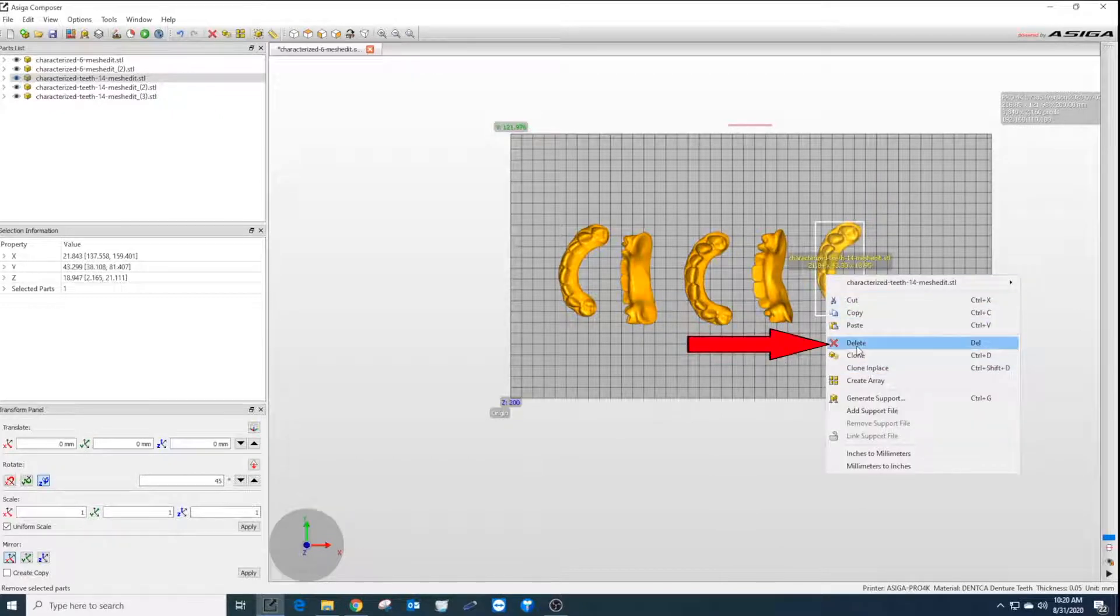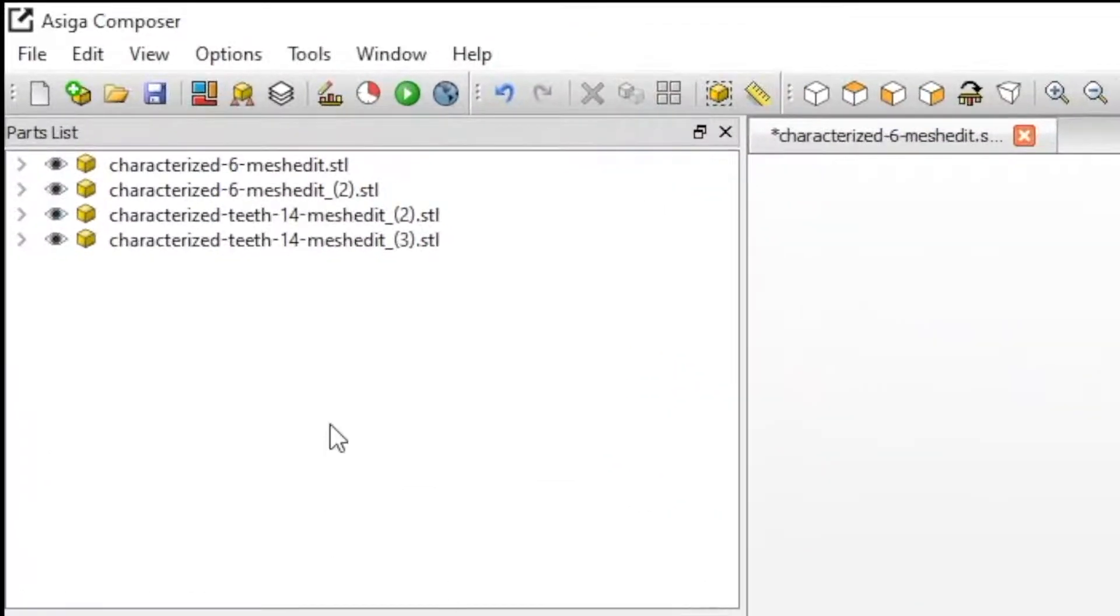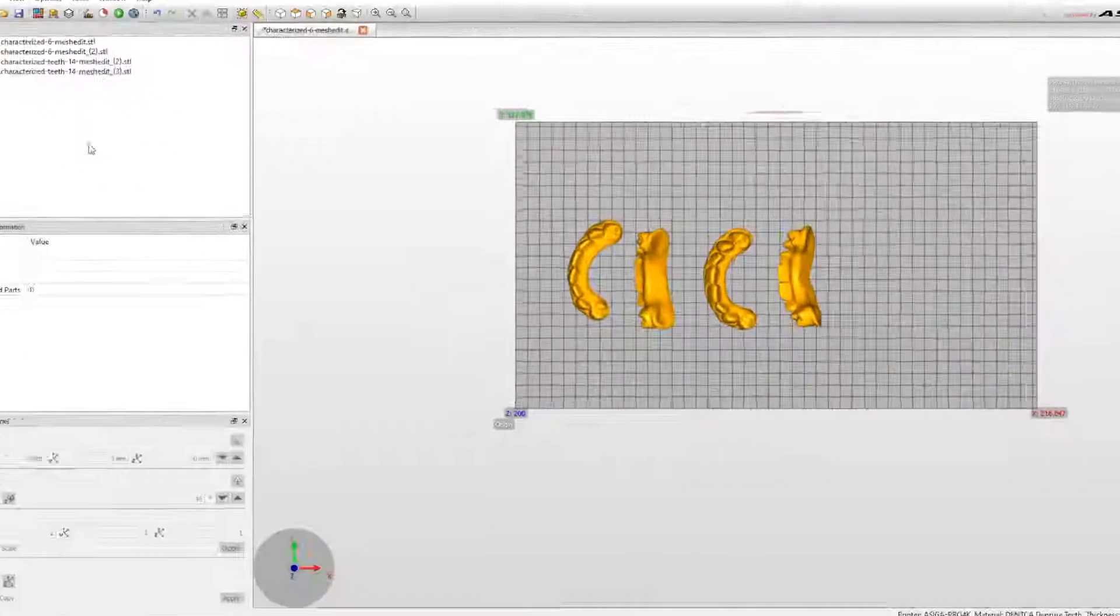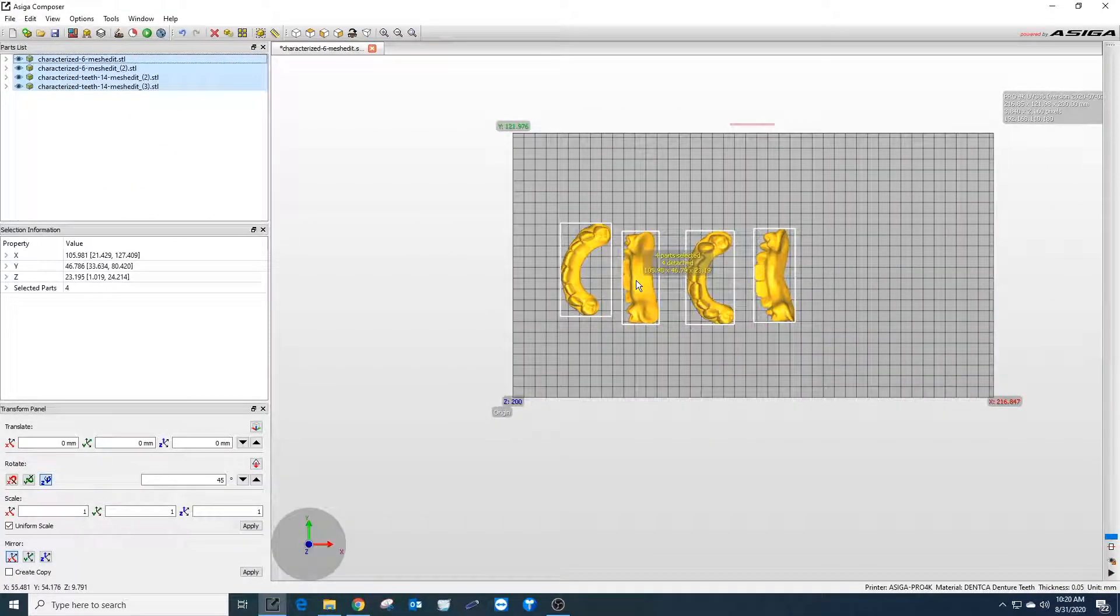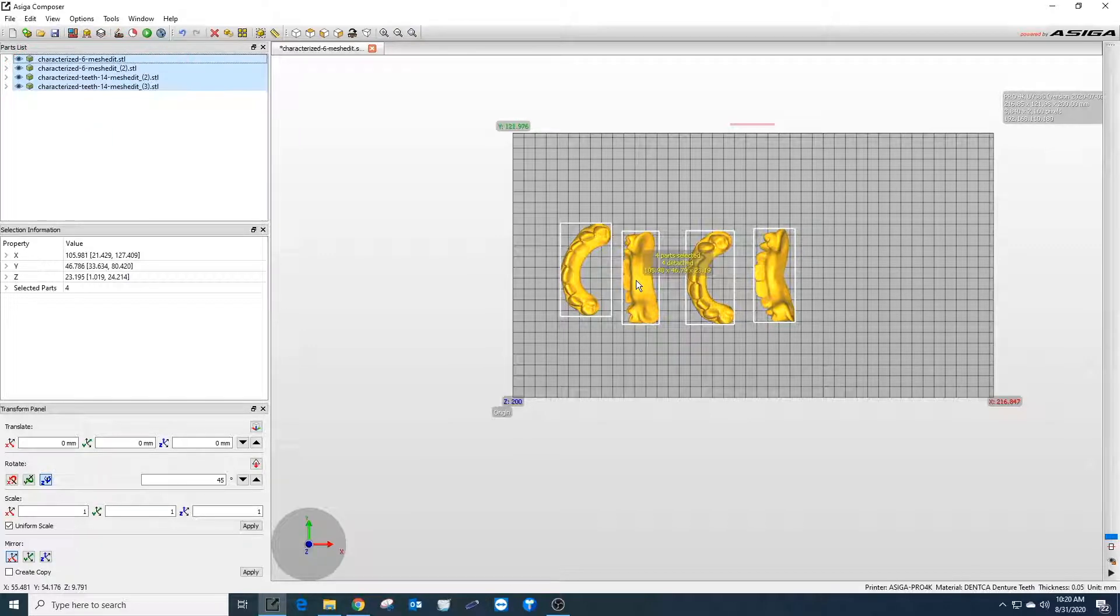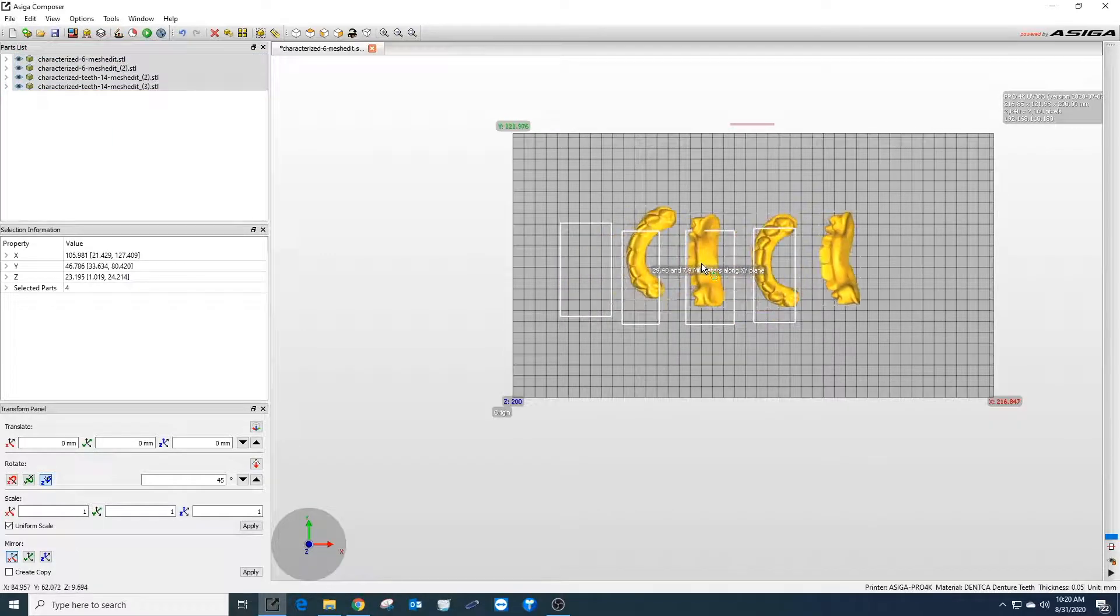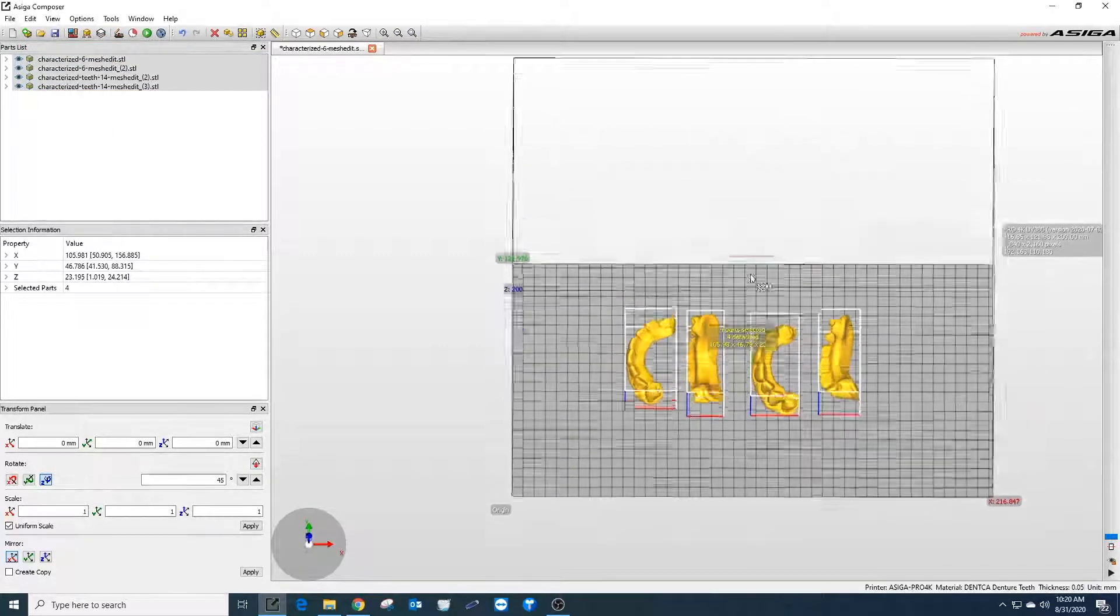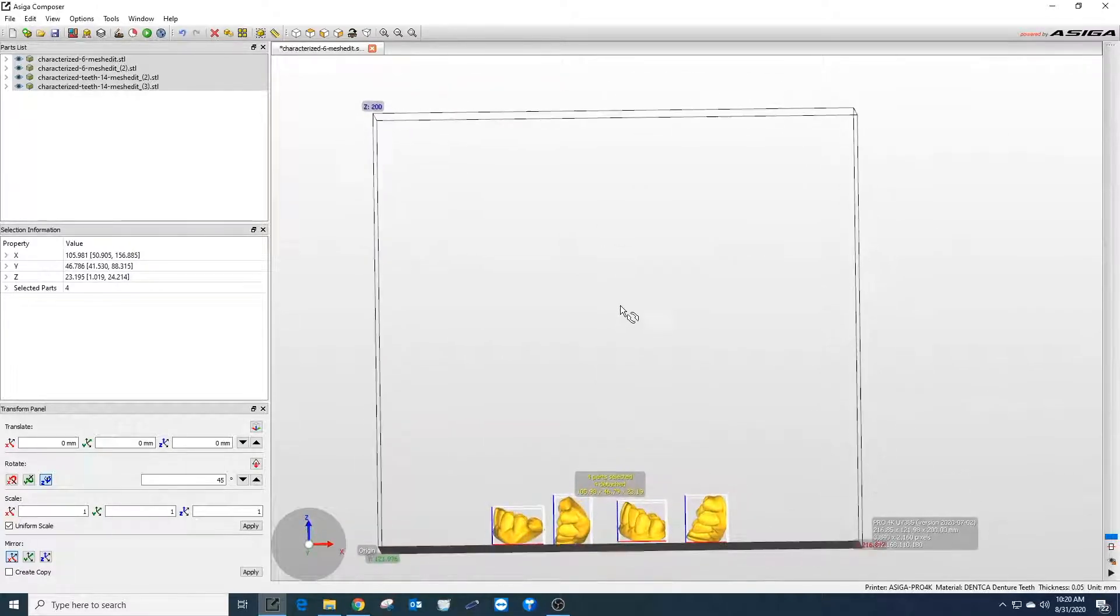In the upper left corner of the build you can see the parts list. Highlighting these will also select the print they're associated with in the builder. To move all the pieces at the same time, highlight all the pieces in the list. Now all the prints can be moved simultaneously into place.